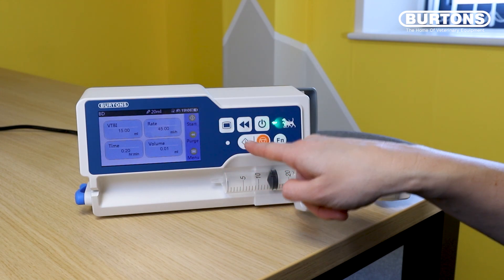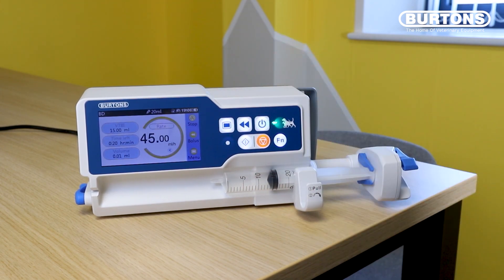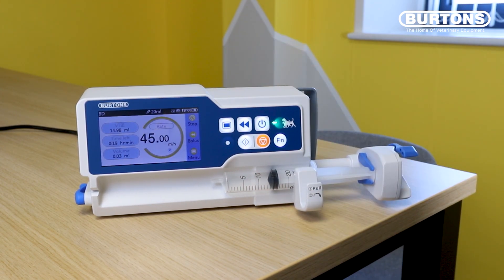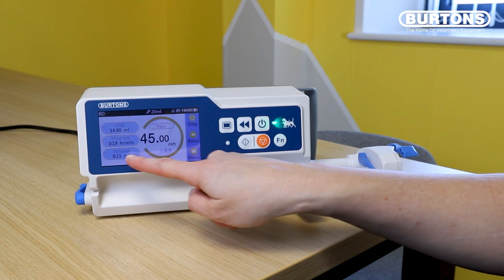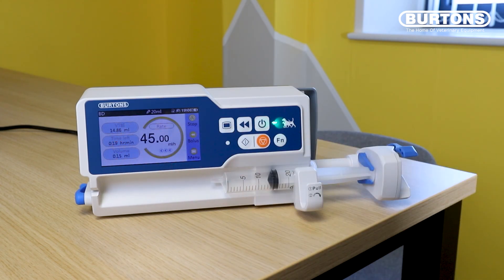We can do that with this button here or this button here. The volume that has been administered to the patient so far is down on this last line here, and then what is left to be delivered is still under VTBI.